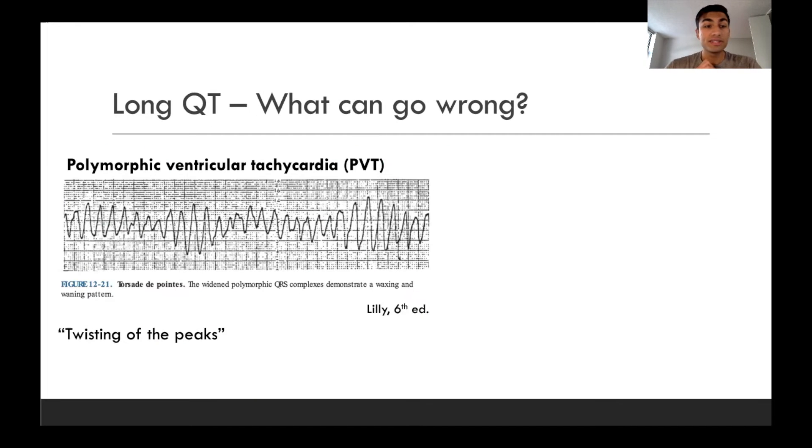Now, lastly, if the QT interval is lengthened, so we have a long QT, what are some of the things that can go wrong? So the main concern is what's called polymorphic ventricular tachycardia, or PVT. And when we have this EKG pattern in the setting of a long QT interval, it's called torsade de pointes. And this is a French phrase, which literally means twisting of the peaks. And so you can see it's characterized here by this undulating pattern of varied ventricular activity, as it's twisting around the isoelectric baseline of the EKG. And this is thought to be caused by early after depolarizations that are precipitated by the long QT interval.